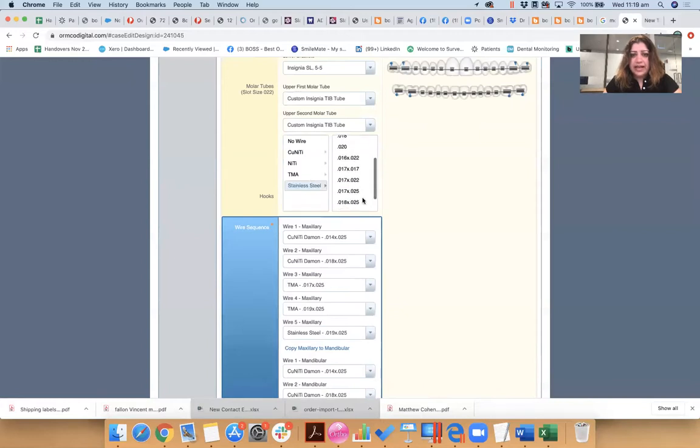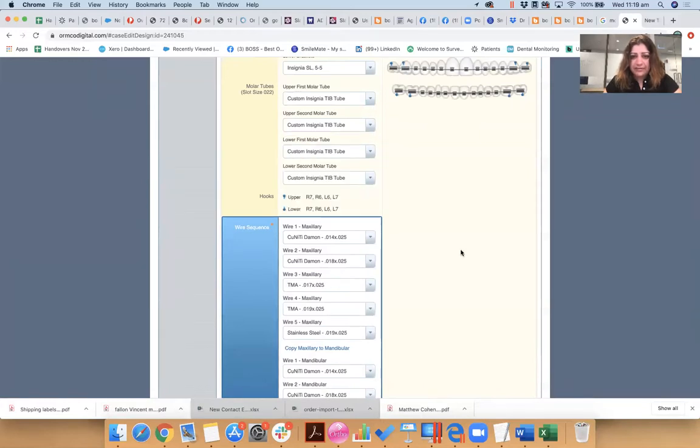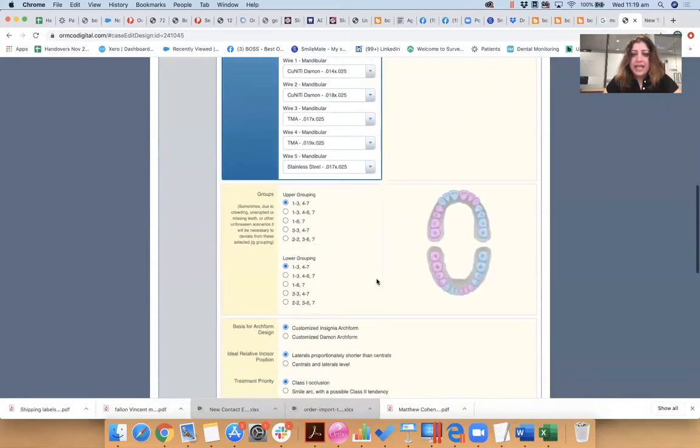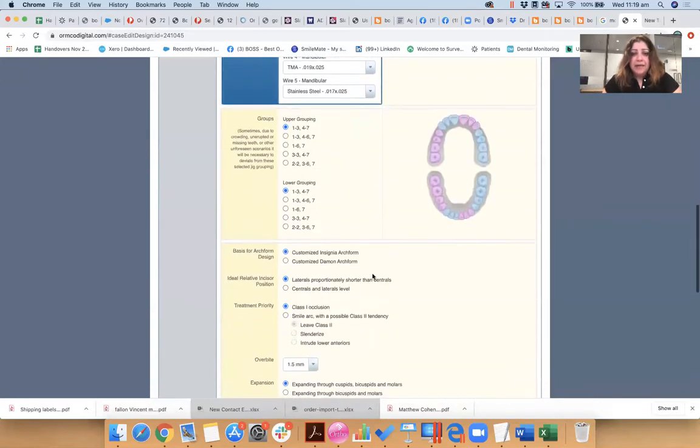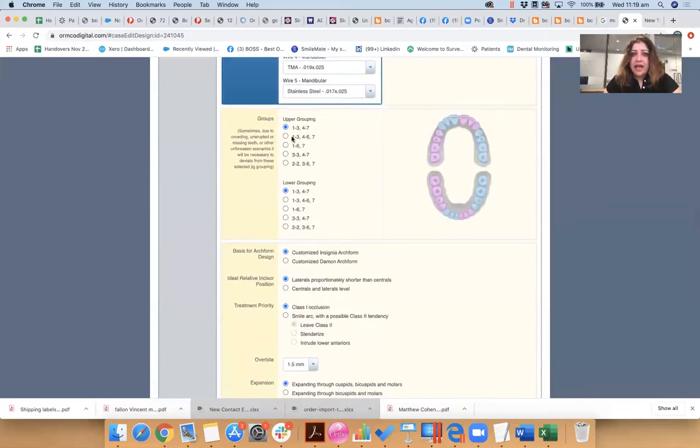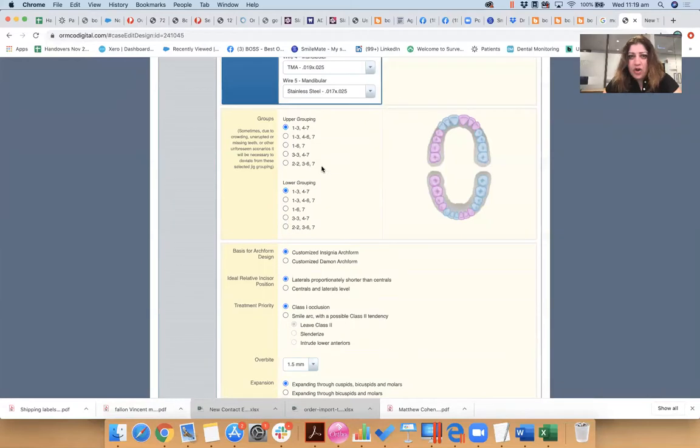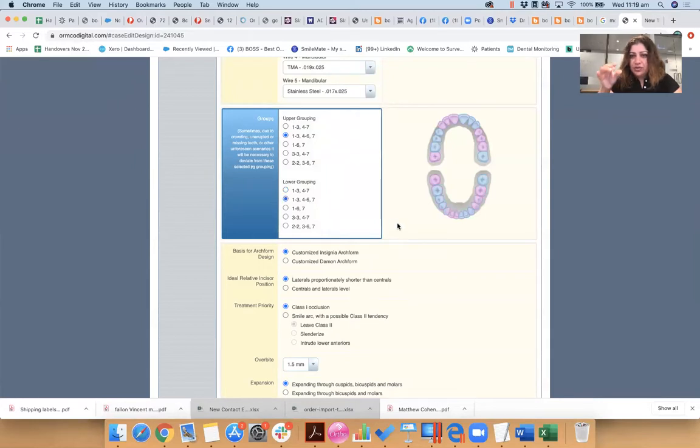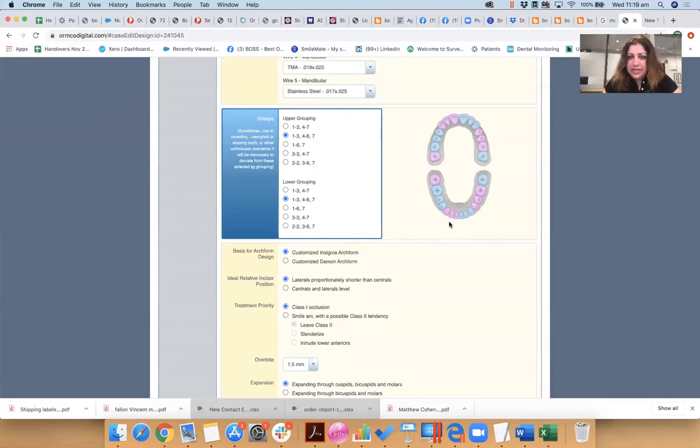So I might actually just do 17x25 for the lower, okay. Now you can choose what kind of grouping you want, whether you want to put your threes together. I kind of like this kind of grouping, so just, you know, this is how your teeth will be delivered and it makes it easier for me to place brackets.